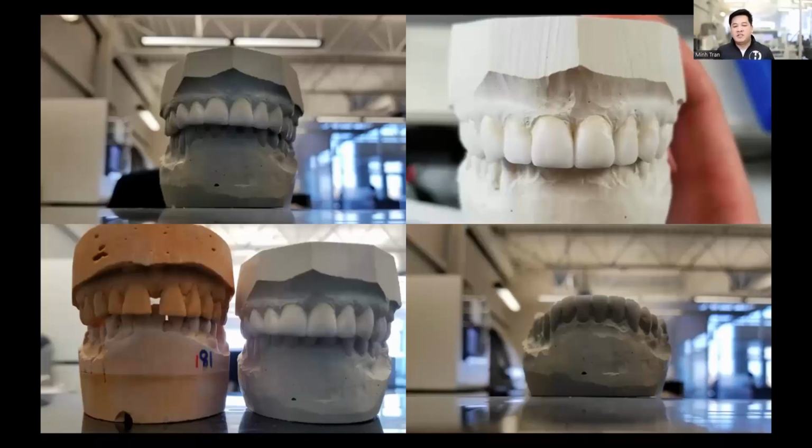And I remember having to do these by hand, and maybe on that number 2-1 or number 9, using the American system, maybe you get hung up on the way that it looks there. You keep that tooth, not necessarily because it looks good, but because you spent some time on it, right? And you kind of build the rest of your wax-up around the aesthetic of that tooth. And it looked okay, but it's not as good as it could be. And going back, the way things were done traditionally, it takes a lot of time to do these things. So there's a lot of investment, a lot of emotional investment. You get attached to these cases. And they don't look as good as they could.